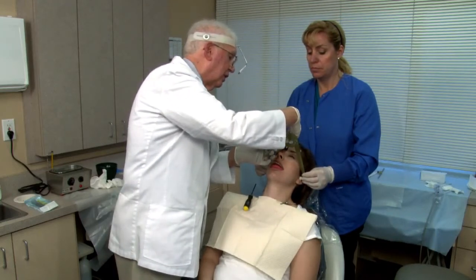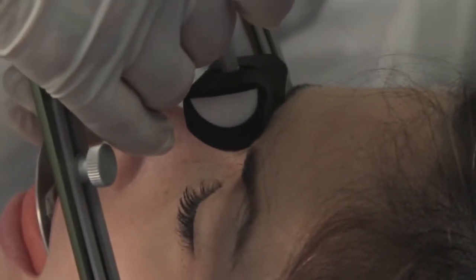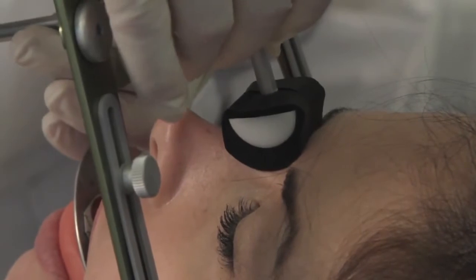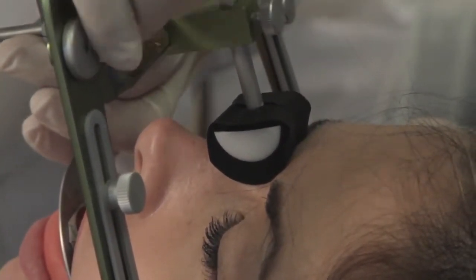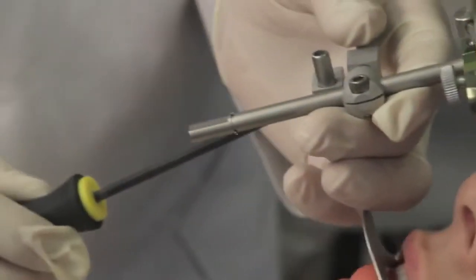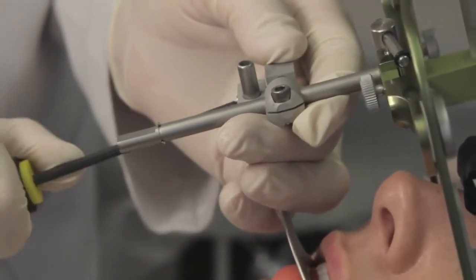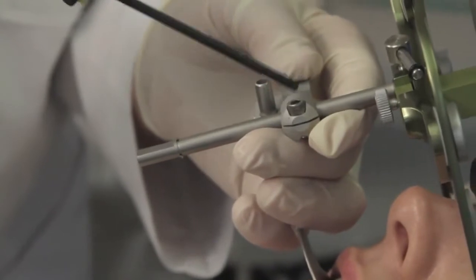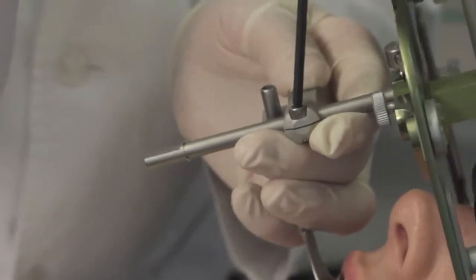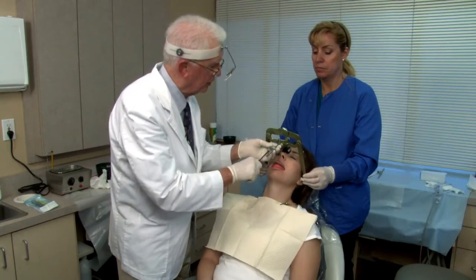So I've got to raise it a little bit, and I'm going to use it like a plunger. And I'm going to push and ask. Notice I've never let go of the bite fork assembly here, and I'm going to tighten the lower one first, then the vertical, and I'm trying to counteract the torque with my left hand.